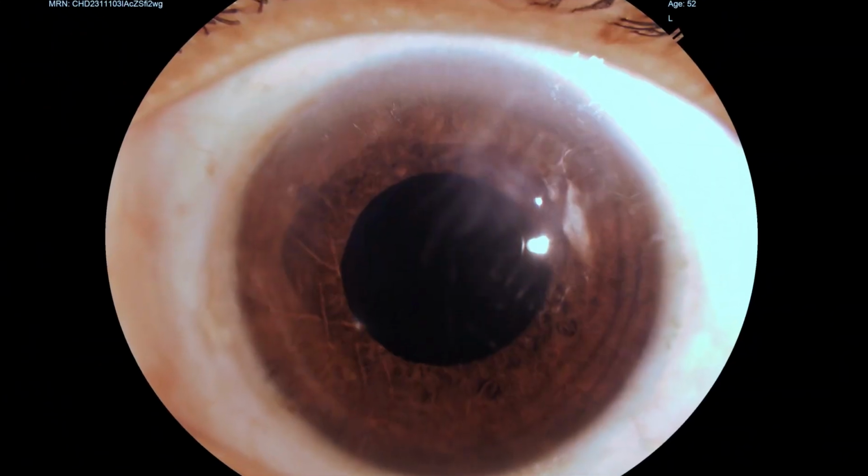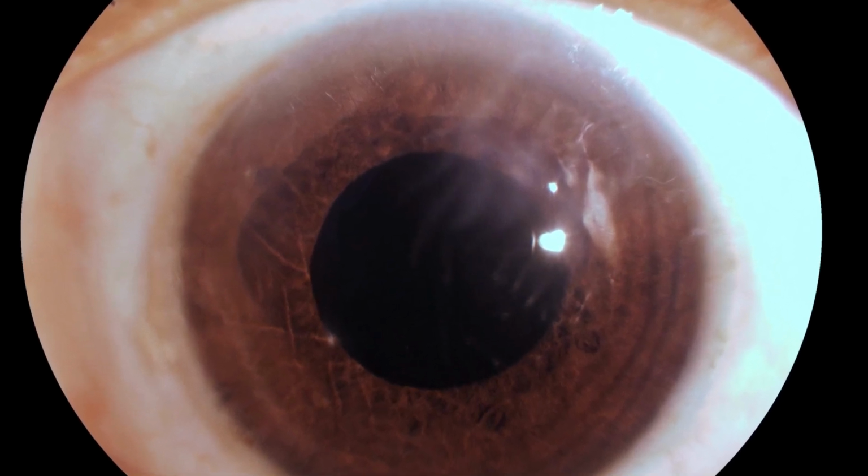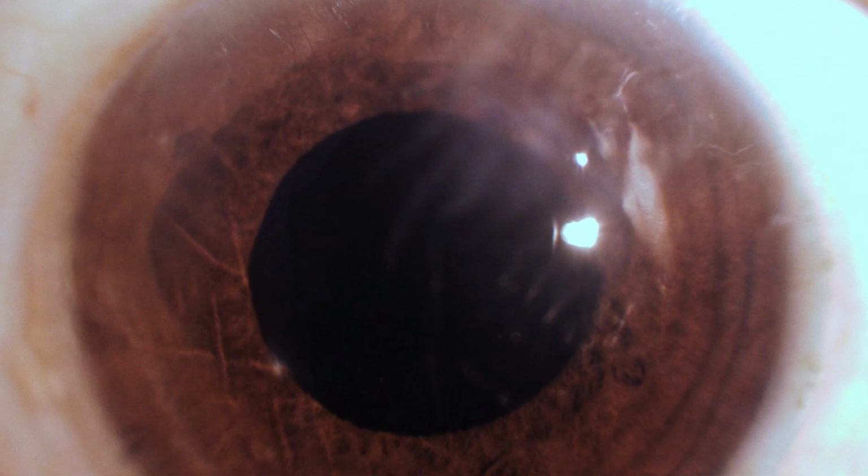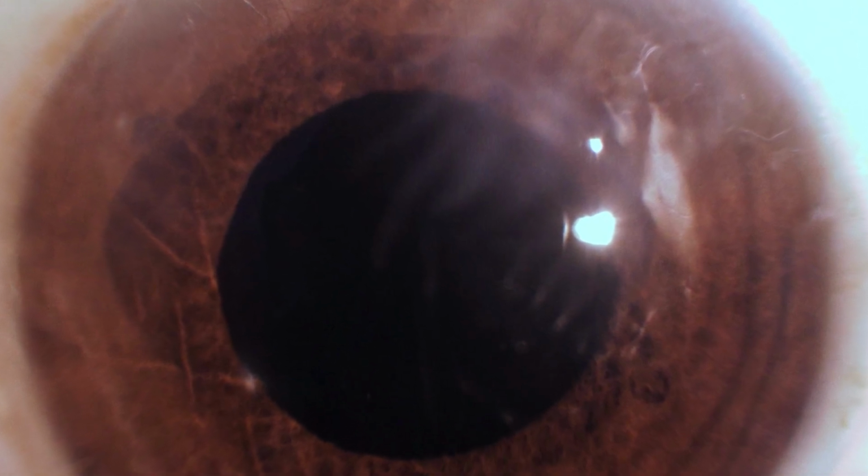This is the day 1 post-op picture, and we can see the cornea has some keratitis, but the patient had good vision, that is 6/18 BCVA. Thank you.